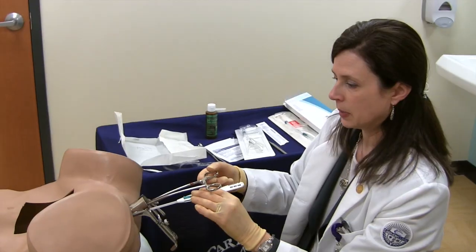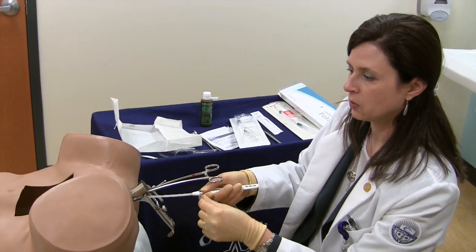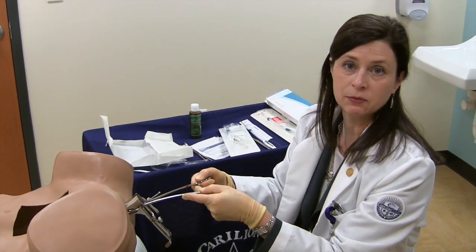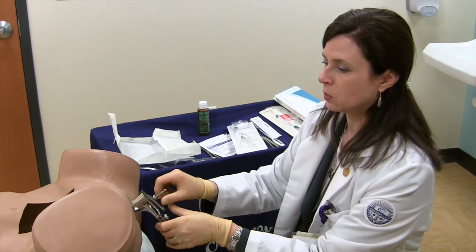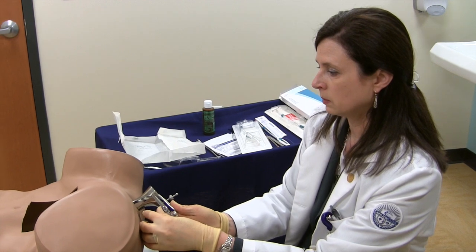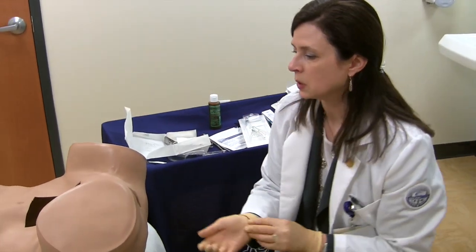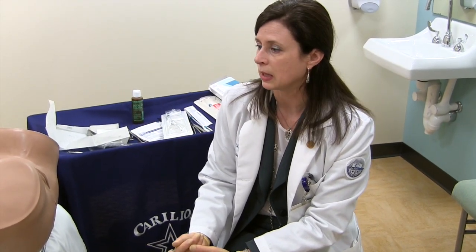The same workshop can be used for IUD removal, and it is very simple to talk them through how to do that as well. At the end, one can highlight what to do if there's any bleeding from the tenaculum sites, whether it's application of Monsel's solution, and then certainly the removal of the speculum. Afterwards, it's helpful to go through what patient instructions you would give, what things they should be looking for, when you would want to see them back, and to talk through at the end of the workshop the patient instructions and warning signs that the provider should cover.